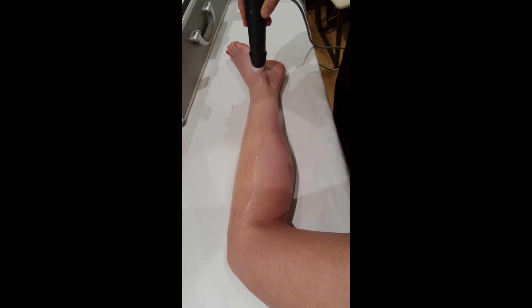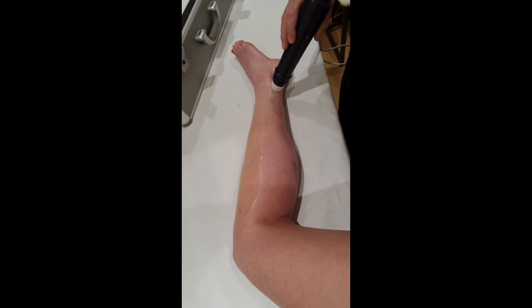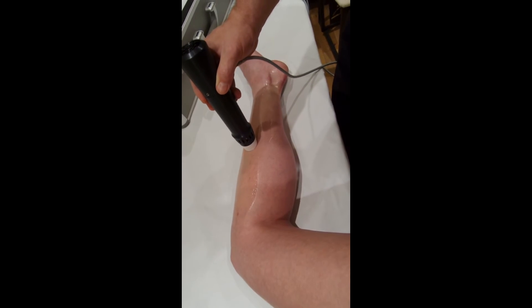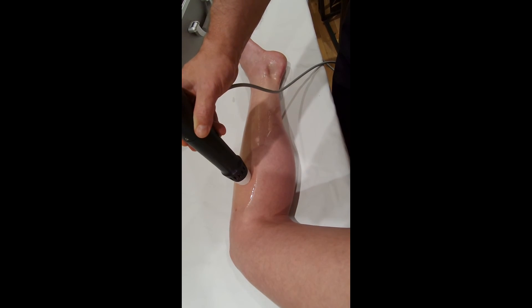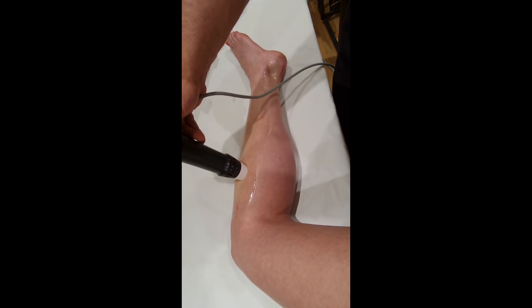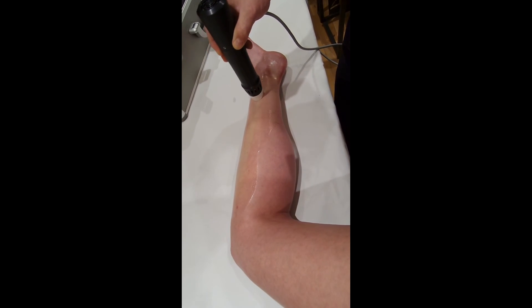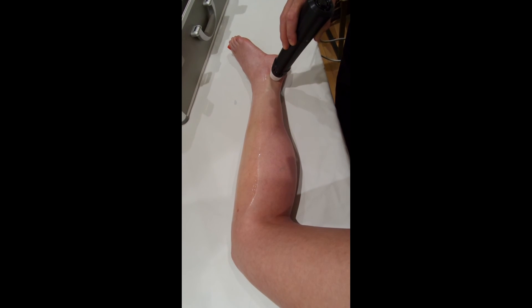Once again we're looking for changes in tone. If there's a deeper, more resonant tone, you can hover around that area and treat it over and over again. You can use tone once you get used to listening to how the machine sounds — a lighter, tinnier tone usually means the shockwave's not going very far. A deeper resonant tone usually means it's found a transition between tissues and it's actually working on that transition, creating some cavitation.